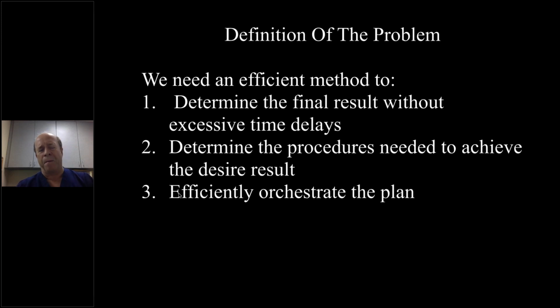What do I mean by that? If a patient comes in and we say we need a setup, then the patient would normally or traditionally go to the dentist. They would take impressions and they would have the lab set teeth, because most dentists don't do that. And then they would get some sort of model back, and then to translate that into your actual surgical procedure or plans is difficult. So we use digital imaging to do that, and the time delays are minimal.